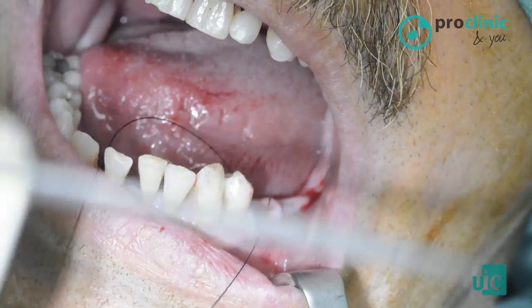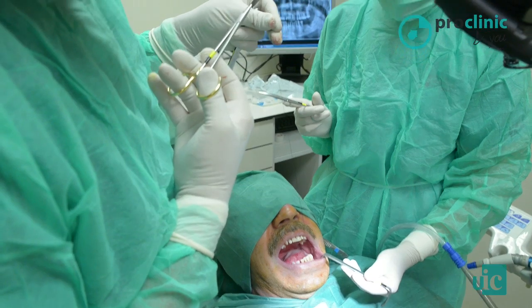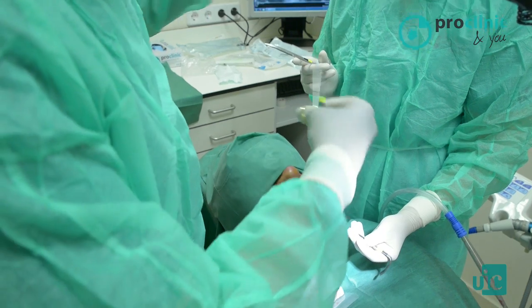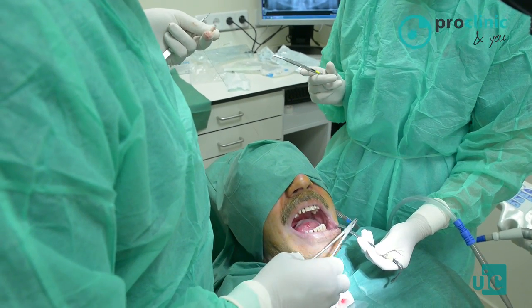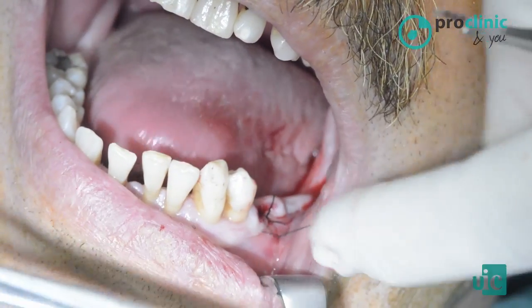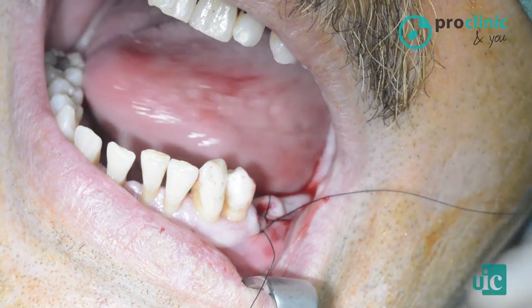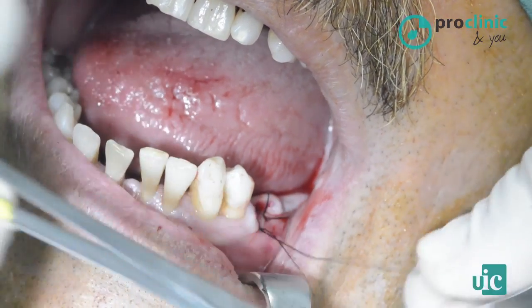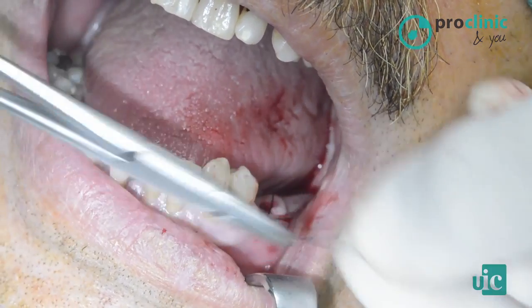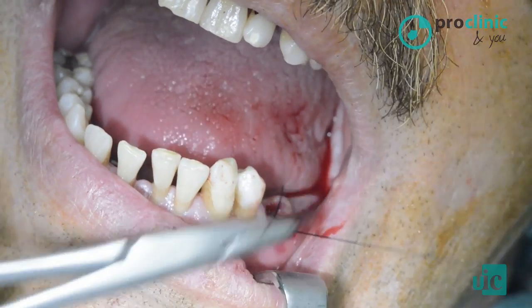The movement must be semicircular. Semicircular. A double one. We should always place the knots on the buccal side. Outside, all right? Very good.